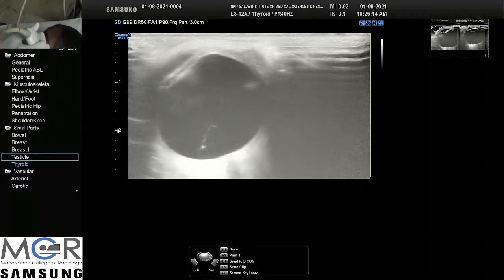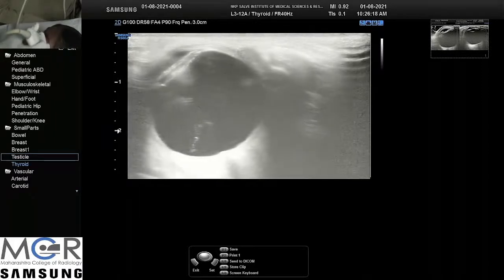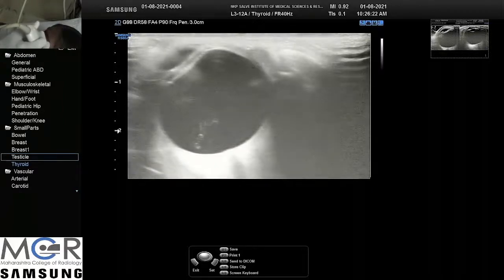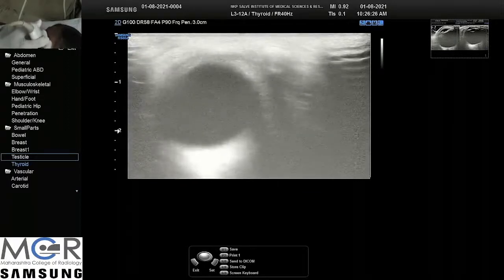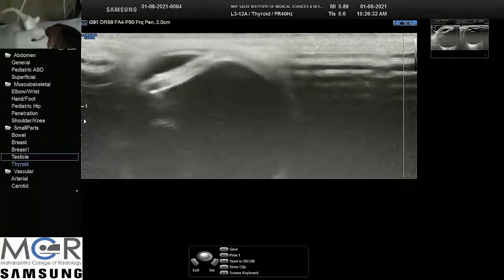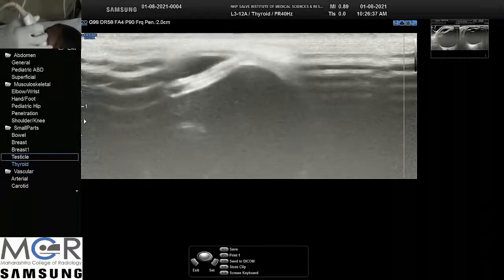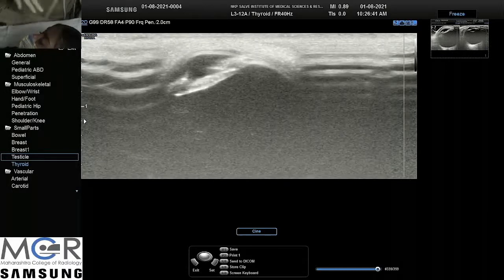So she has moved the eye a little bit, and we can see that it is free floating. So we can take them as floaters and not as membrane, because they are of varying thickness and discontinuous. So the only finding in this case is that the lens has lost its normal biconvex appearance and become echogenic. So this could be a traumatic cataract. Okay.